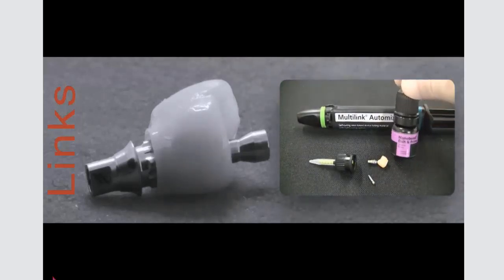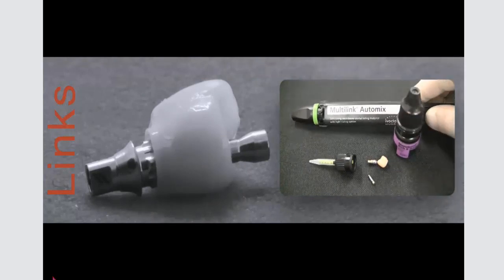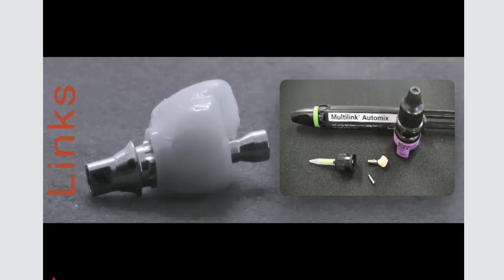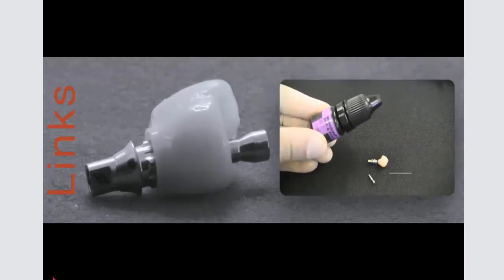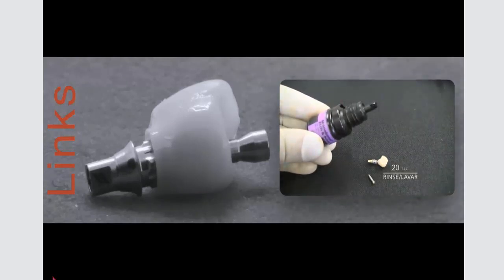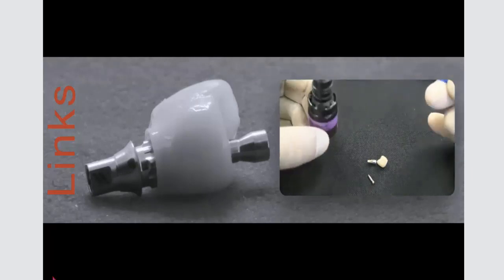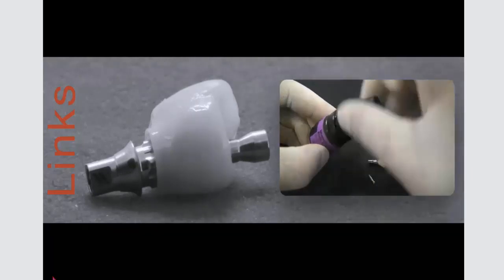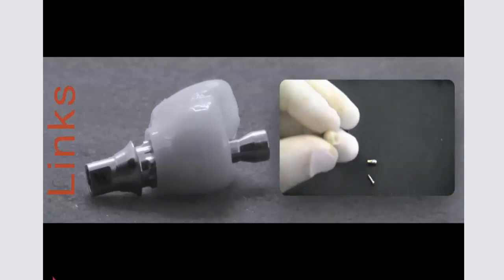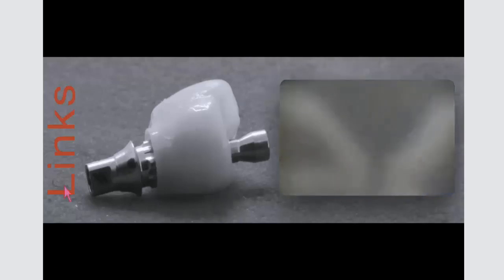I use Ivoclar products, which is, I like this etch and prime. I'm just getting used more and more to do it. But again, for a crown, I don't see any problem because you have enough retention. You use that, so you apply for 20 seconds and then rinse, and you're ready for the cementation. Very straightforward, very simple process until you get to the end of the result.